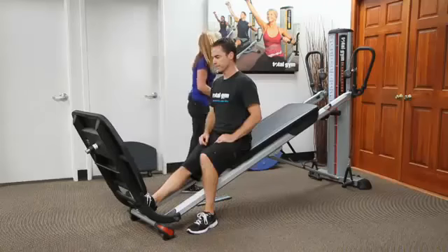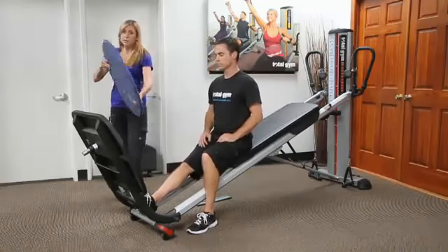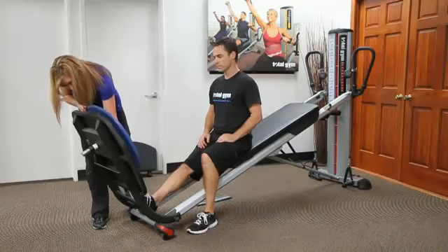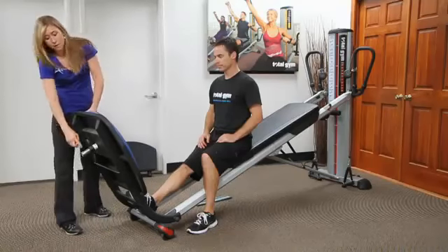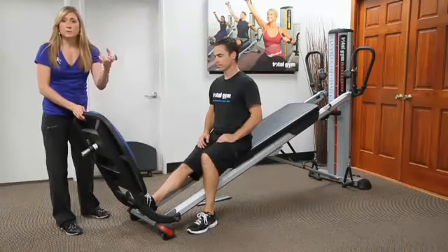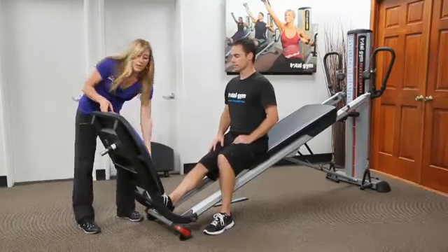And then you can add in the BAPS board. So just like you would attach a ball, you can place the board on. And according to how far out you have it, he can now use the BAPS board and he can do squats, he can do just mobility training, whatever he wants, whatever your intention is for that patient.